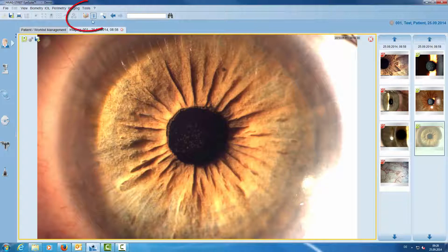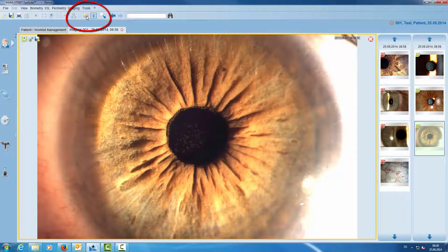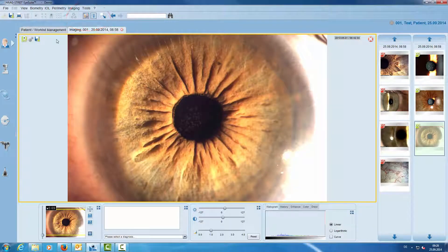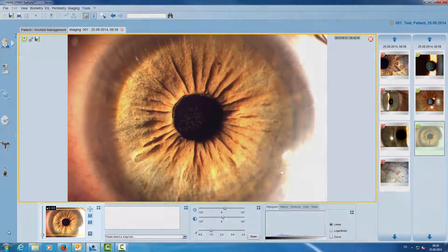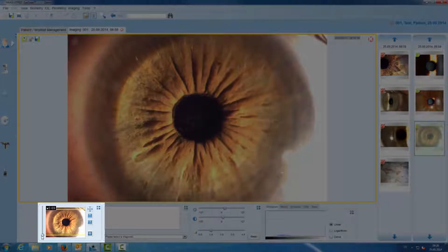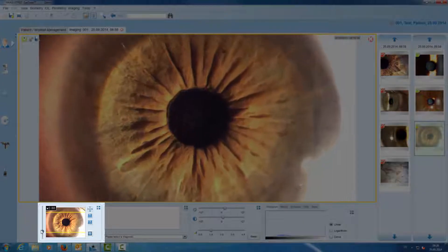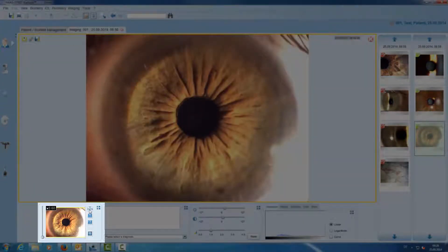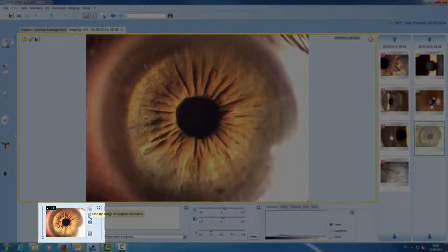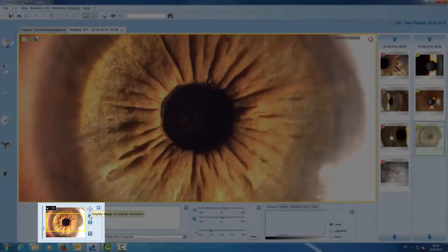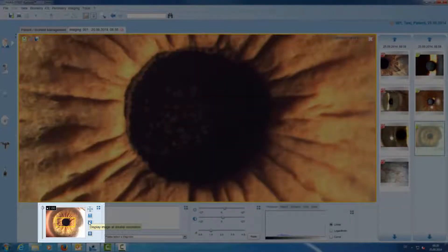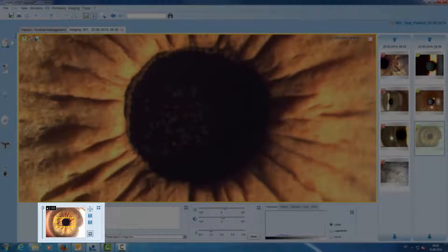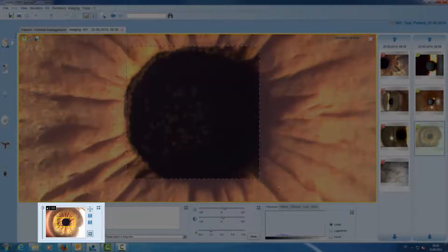If we need more tools we open the toolbox. Here we have our navigator tool where we can zoom in either with a slider on the left side or step by step. It also provides us with the possibility to crop the image.